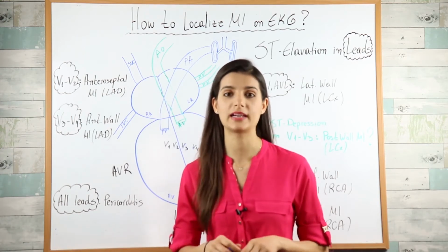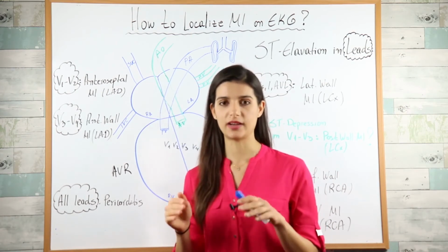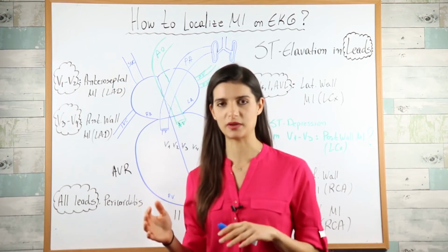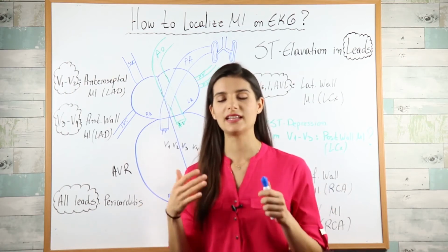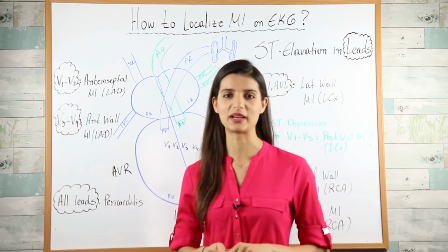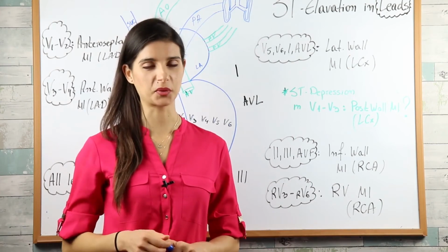And another type of pericarditis that I would like to mention is the post-MI pericarditis. It's subdivided into early and late post-MI pericarditis. The early one happens less than 4 days post-MI, and the late one, as we all know, is called Dressler syndrome. Moving on to the inferior wall MI, and let's see why it is so important.